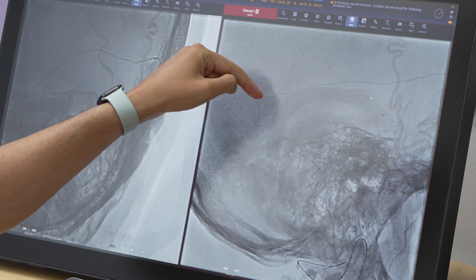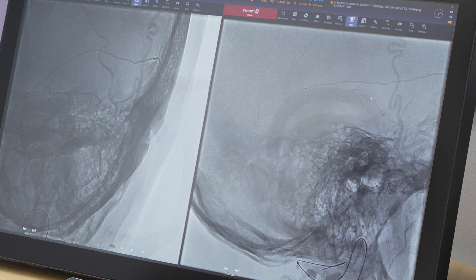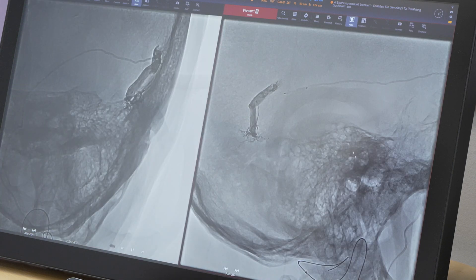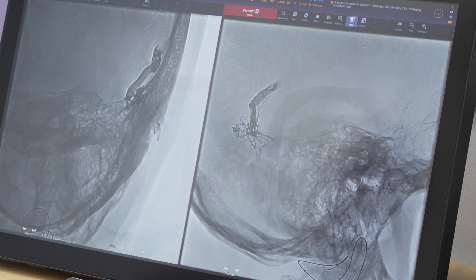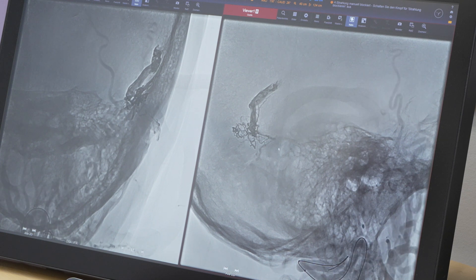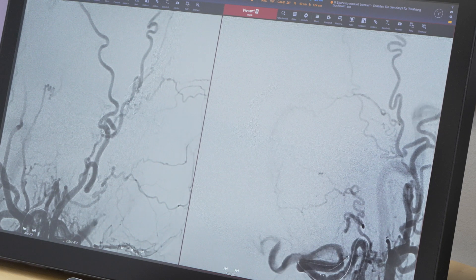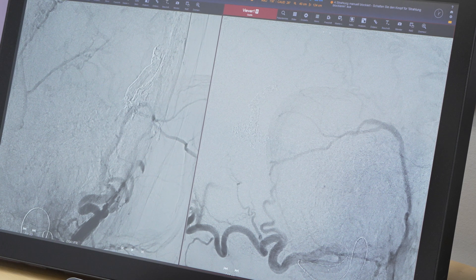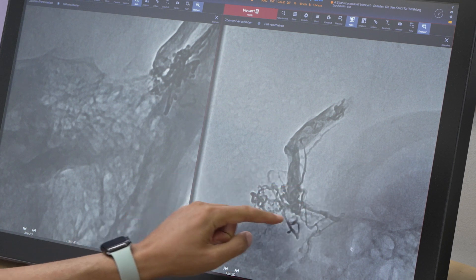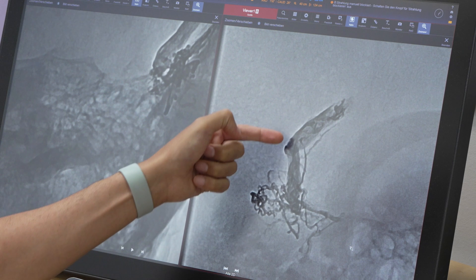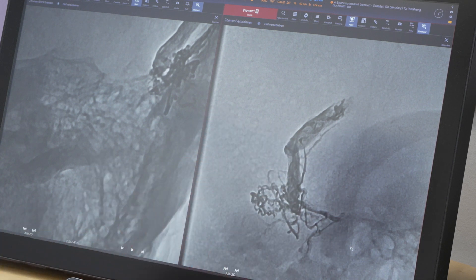We inflate the Scepter in the occipital artery and start injecting from the MMA branch. This allows us to occlude the whole fistula. You can see the first cast with nice dissemination of the liquid embolic in the collecting vessel and the proximal part of the vein. In the final angiogram, after deflating the Scepter, the fistula is treated — with really nice dissemination of liquid embolic in all the feeders around the collecting vessel and occlusion of the proximal part of the dilated cortical vein.